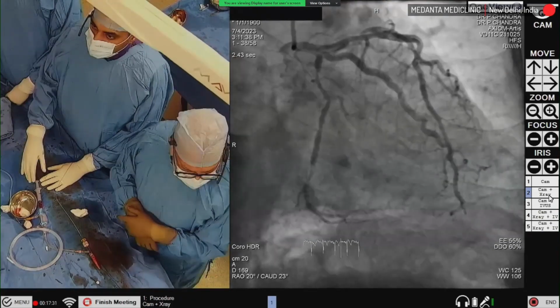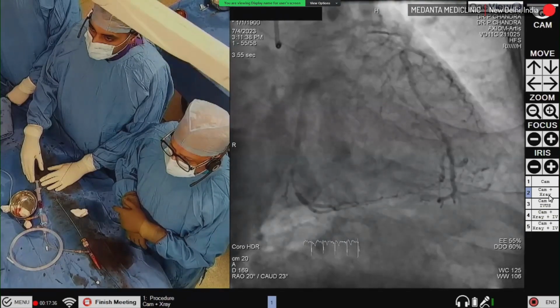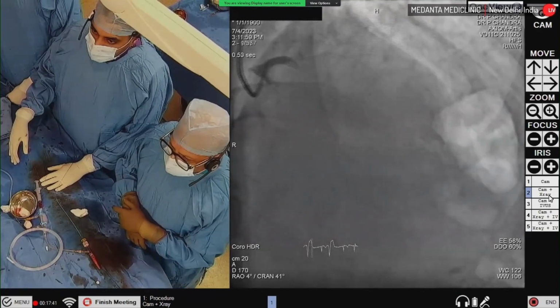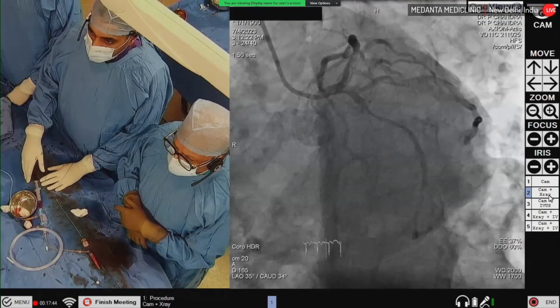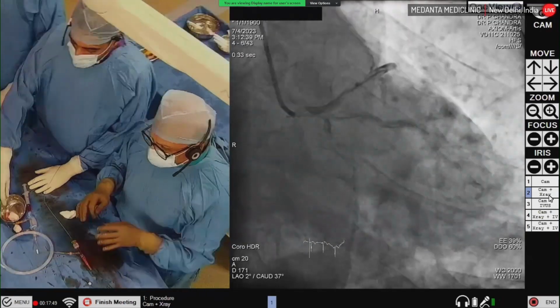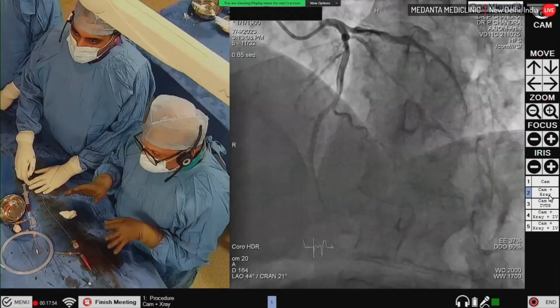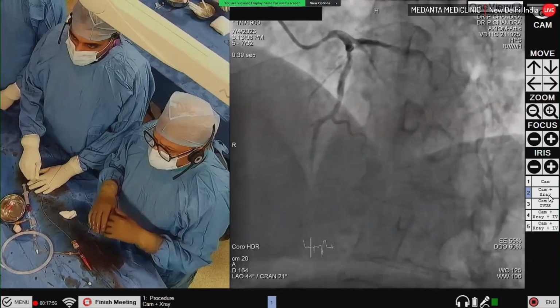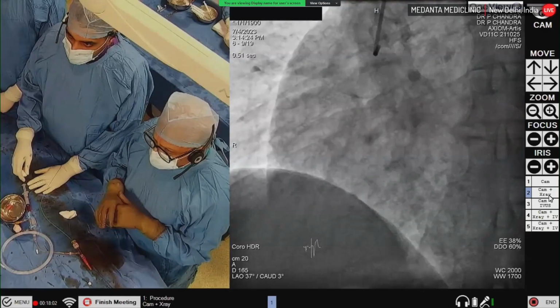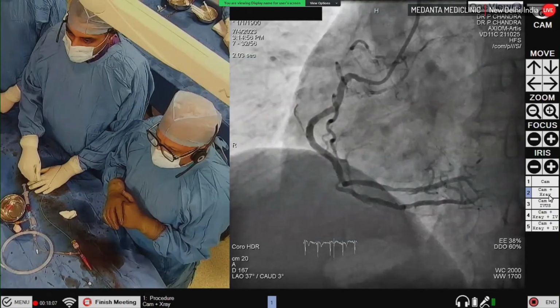There is a large diagonal crossing away from that point, having ostial disease of almost 60 to 70%. And the right artery. You can see these images in different views: the circ is a very diffuse artery. The LAD was looking borderline in some views, and in some views going up to a maximum of 60 to 70%. The diagonal is tight, arising from that lesion. And the right artery, which was stented 3 to 4 months back, is patent.